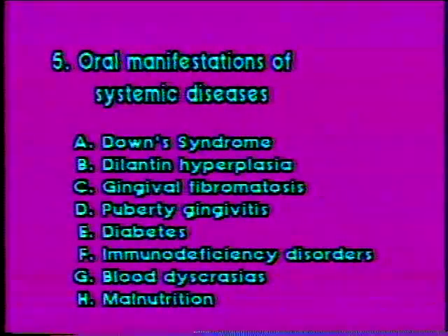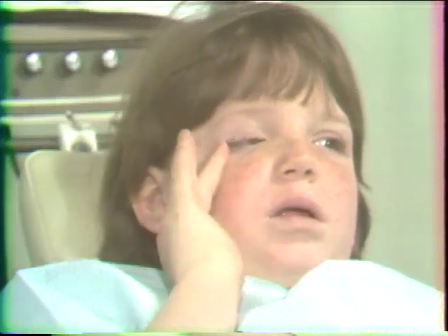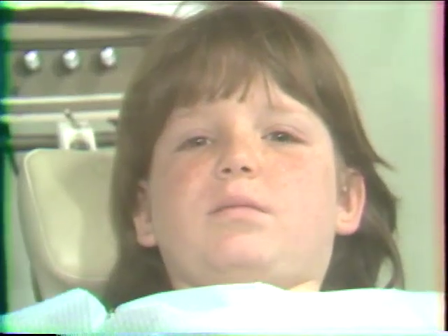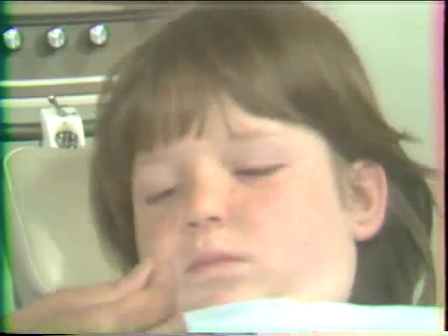Plaque and calculus removal. Remember to remove any appliances that your patient might be wearing before beginning your prophylaxis. Next, take into account the comprehension level of the patient. You should, in appropriate language, introduce the child to the steps in the prophylaxis by the show and tell method. First, instruct the patient to chew a disclosing wafer.